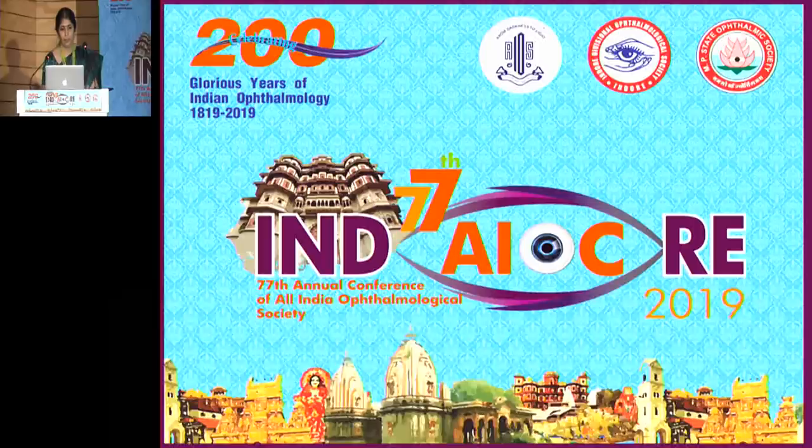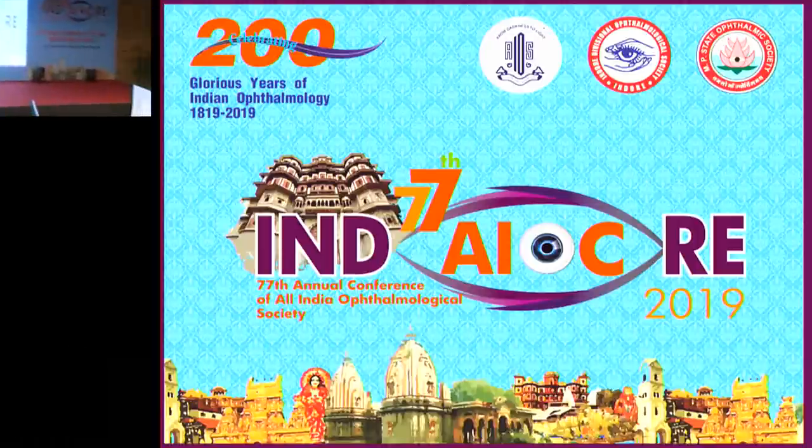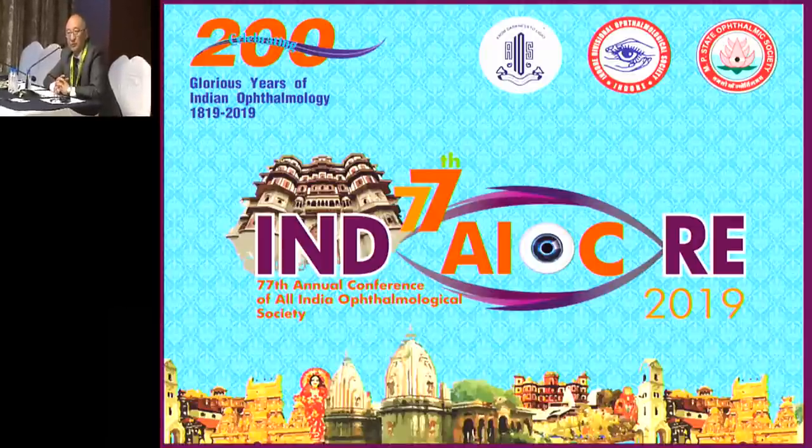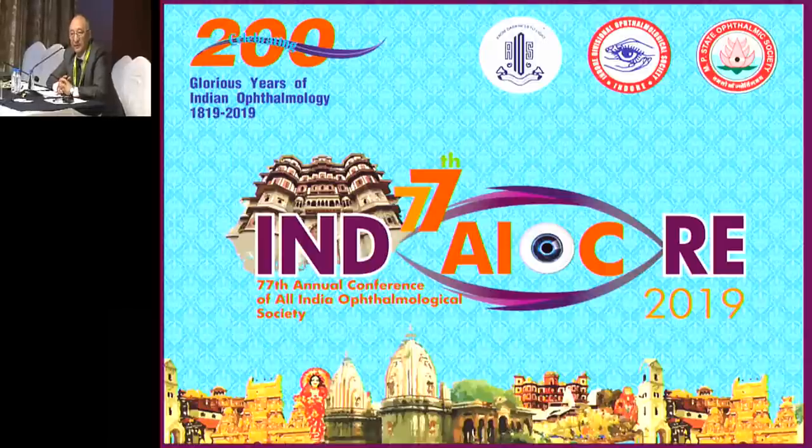Thank you, Dr. Haripriya. Looking into the current trends in cataract surgery, I think the entire game is basically to get oriented to the system we are using. Every system may be good in your hands, and that has to be made better in your hands by practice. In phaco systems, active fluidics has really made a change for us. The balanced tip, along with the fluidics, has been fantastic, as rightly shown by Dr. Haripriya. Even in a difficult situation, you can manage phaco very effectively.